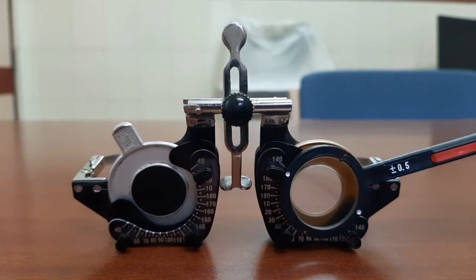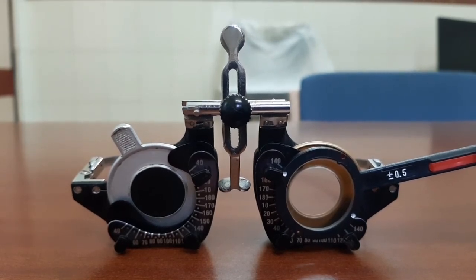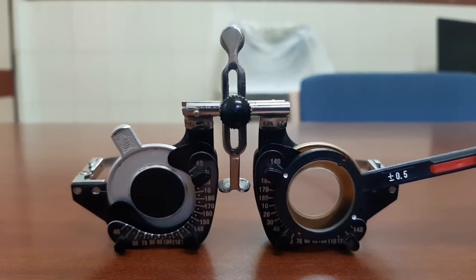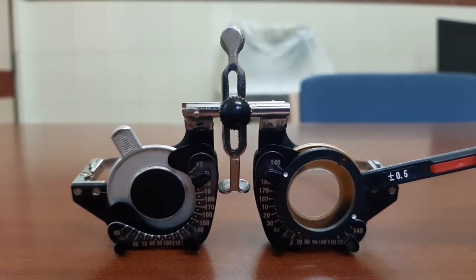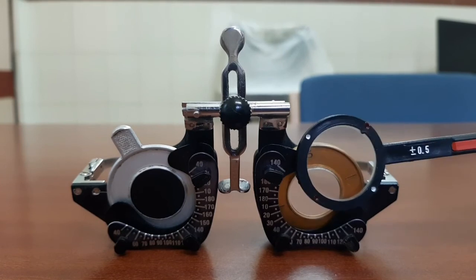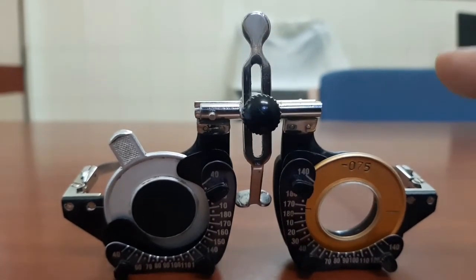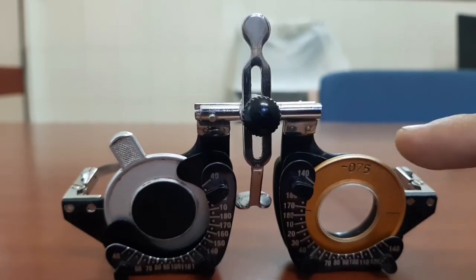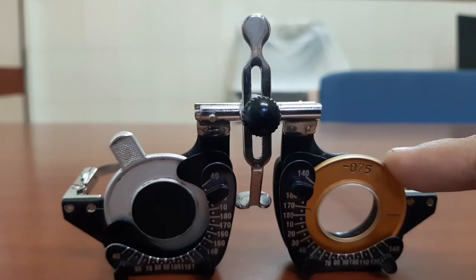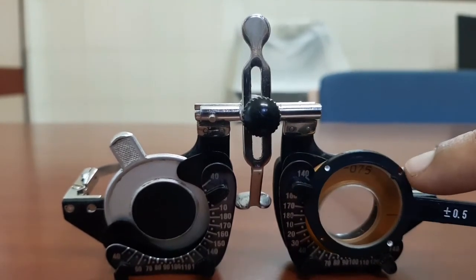Ask which side the patient prefers. If the patient sees the same image on both sides with no gross difference, it indicates that you have found the correct axis. This is how you refine the axis of the cylinder. You move the trial lens according to the sign of the lens — with minus 0.75 cylinder, move towards the red dot.